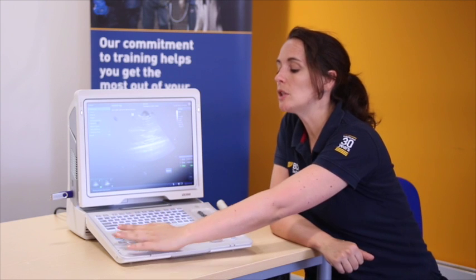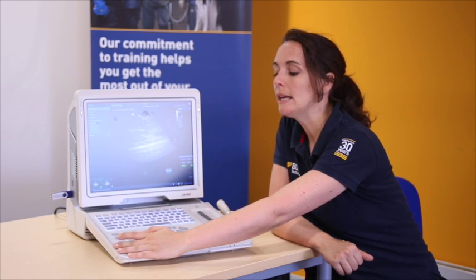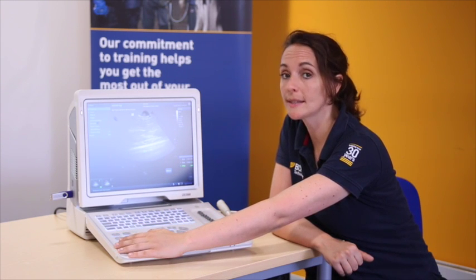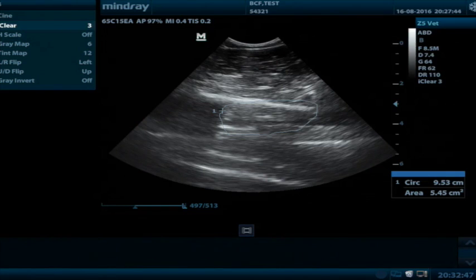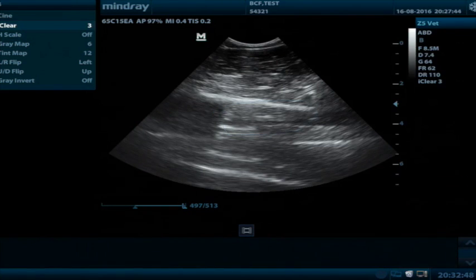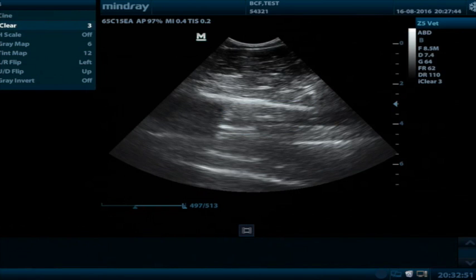If once you've put a particular annotation, comment, or measurement on an image and you want to remove them, all you have to do is hit the clear button, which is on the left hand side of the keyboard, down at the bottom of the cursor button. Just press and hold, and all annotations and measurements will be deleted.